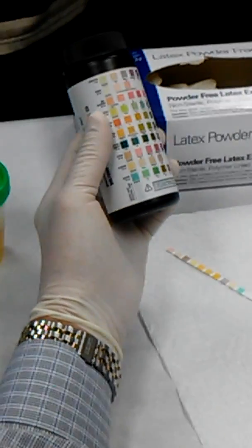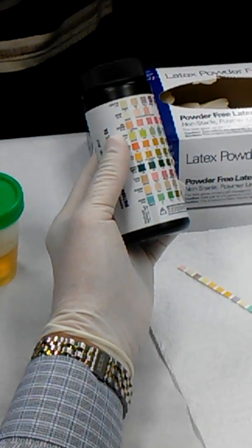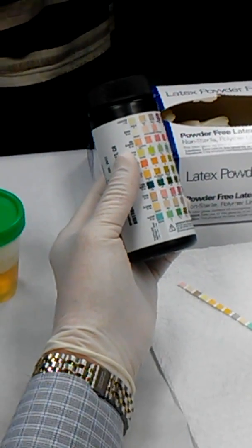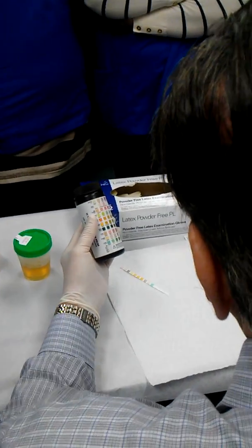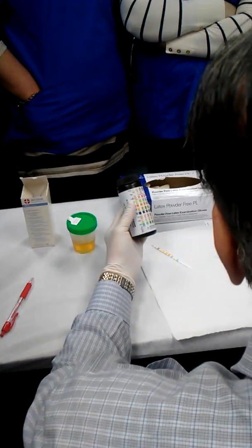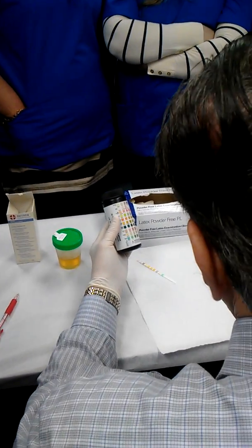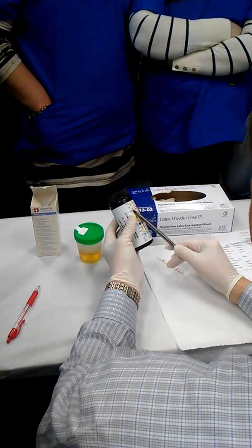Because if you're finding leukocytes in the urine, it's a sign of infection. Okay? It's a sign of infection. And you will write, for example, if you find leukocytes, you will circle positive. If you didn't find anything, you circle negative. And it's written here. If you find leukocytes, it's an indication of inflammation and infection.